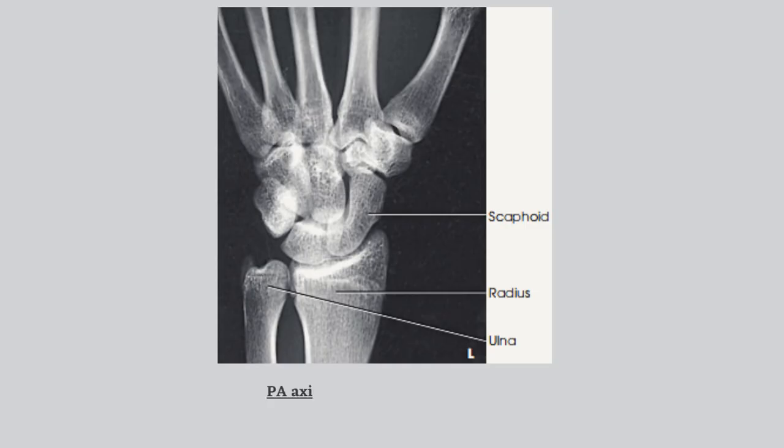Here we have the x-ray image of PA axial wrist for scaphoid, Stecker method.